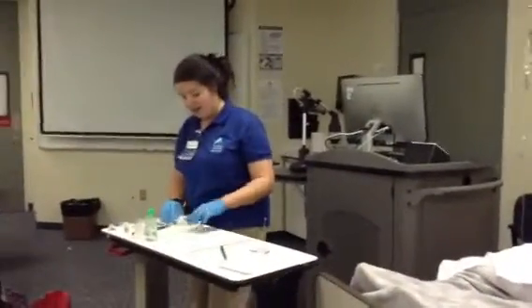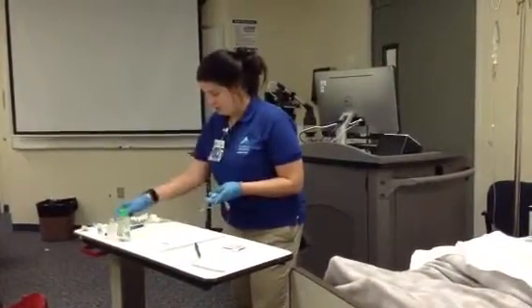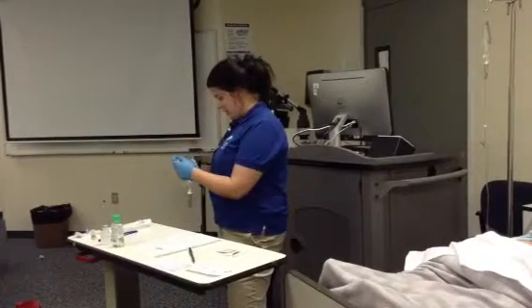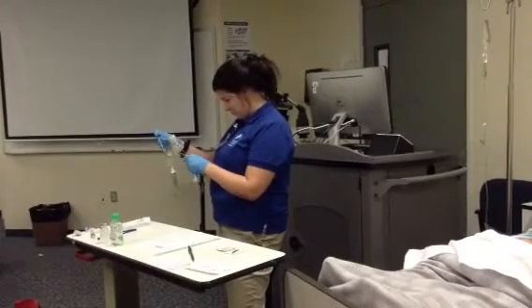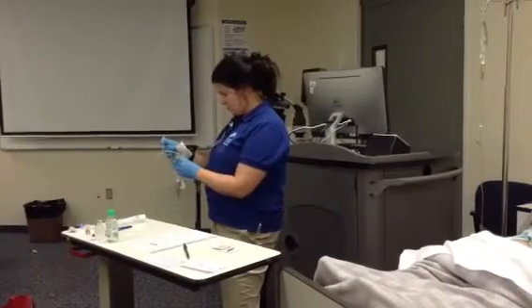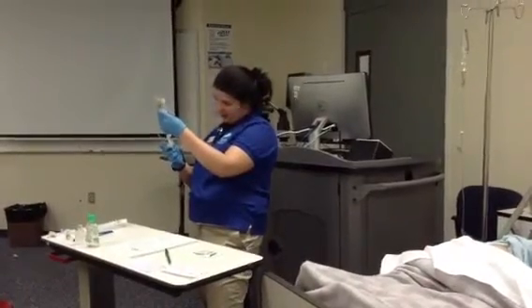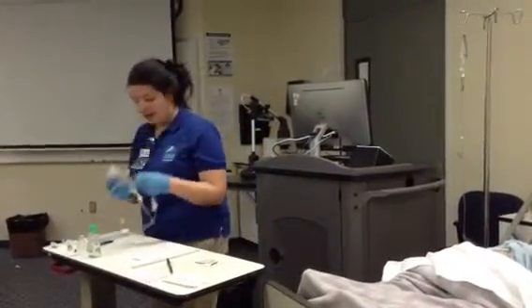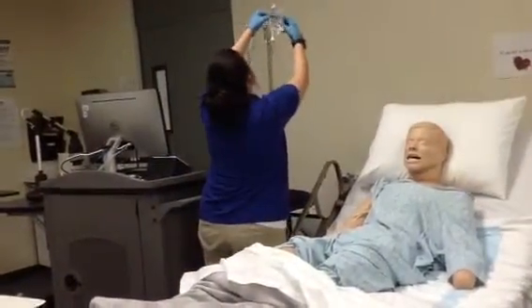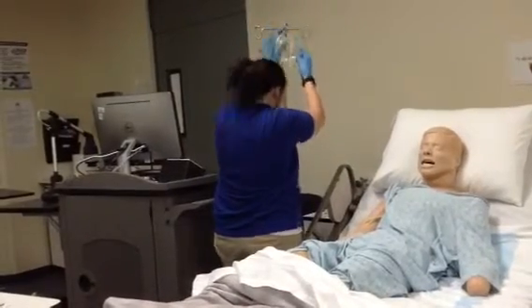I'm going to spike it. I'm going to make sure that it's primed. Okay, perfect. Okay, check my drip chamber. Everything looks good. So that's ready to go. I'm going to go ahead and put this here while I prepare everything else. My Zosyn, which is infusions over 30 minutes.